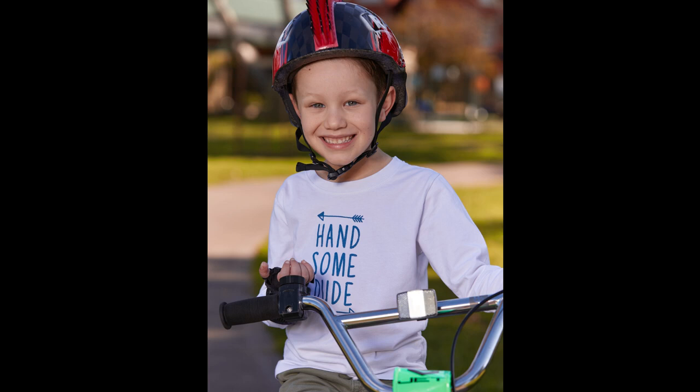I also learned about the innovations and technology available from the volunteers to be able to do this. And without the family's input, we may have used something really heavy or bulky, which would have been challenging for him physically, but also emotionally. So with the family's input, we were able to get this very well thought through design, and without them, we wouldn't have been able to have all the finer adjustments that led to what you see here. And now I'll pass over to Melissa to share her case study.